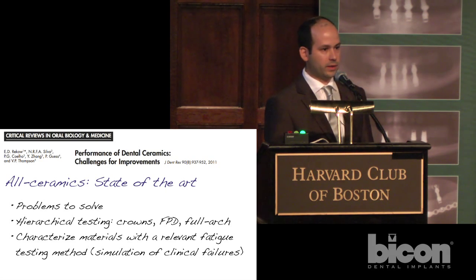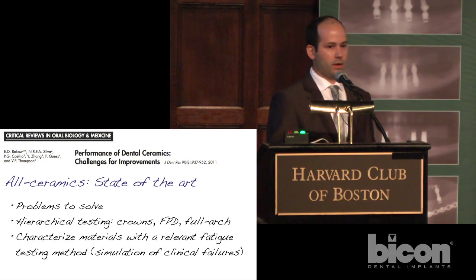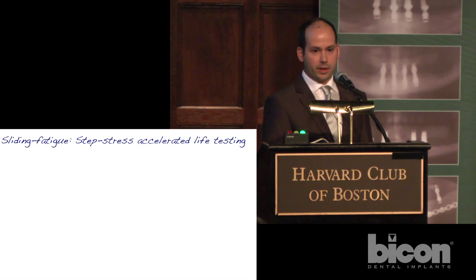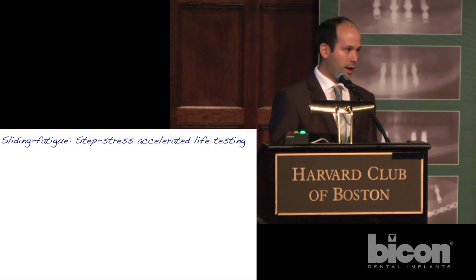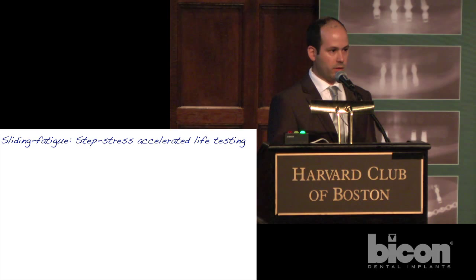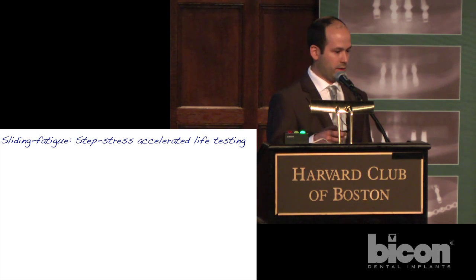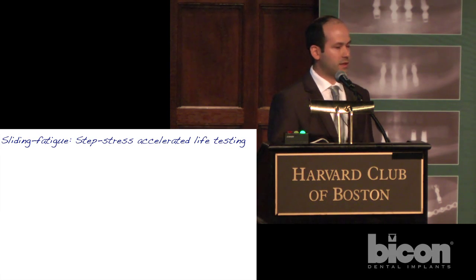And how relevant can it be? Well, we'll see if it simulates the failures that we observed clinically. And this was done a while ago. It was developed at the Department of Biomaterials and Biomimetics at NYU. I'm not going over too much detail on it, but we use sliding fatigue testing and accelerated life testing method.